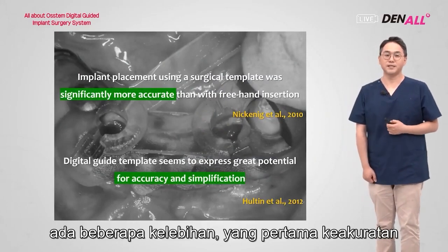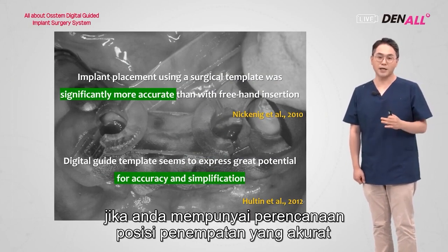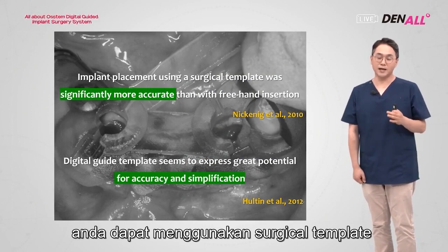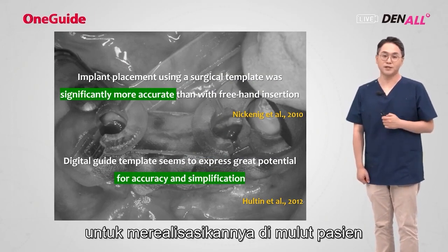When you do guided surgery, there are many advantages. First is accuracy. If you have an accurate plan, a planned position, you can use a surgical template to make it a reality in the patient's mouth.